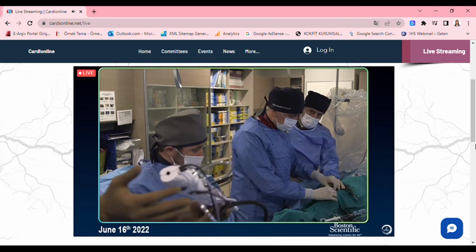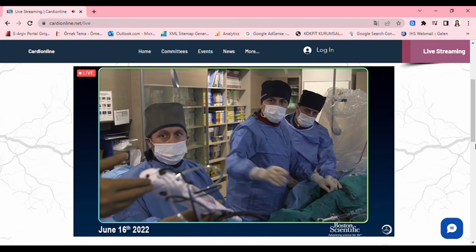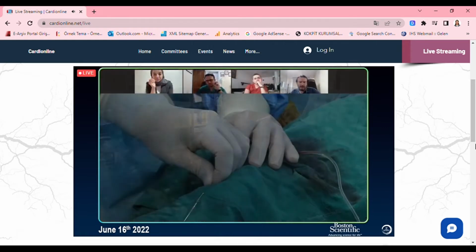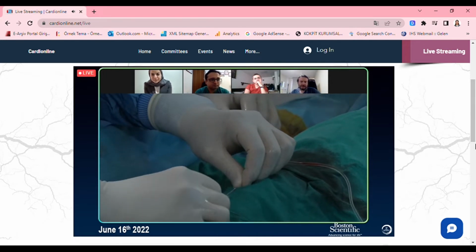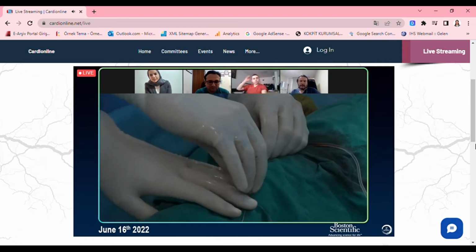No. Not yet. And Ömer, can you give us some insight about your setup? Is it a radial procedure? Are you doing it radial, 7 French, 6 French, 8 French? How is your setup? 7 French. Yeah, sorry. We are working over a 7 French EBU by radial approach.